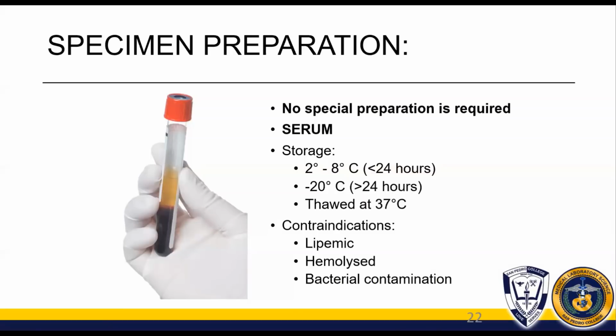Contraindications: never ever use samples that are lipemic, hemolyzed, or with bacterial contamination. Because, class, these contraindicated samples may cause false positive or false negative reactions. Lipemic samples are samples that appear milky.